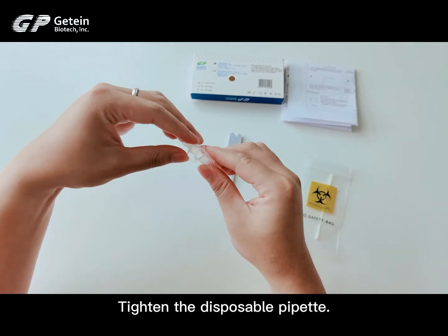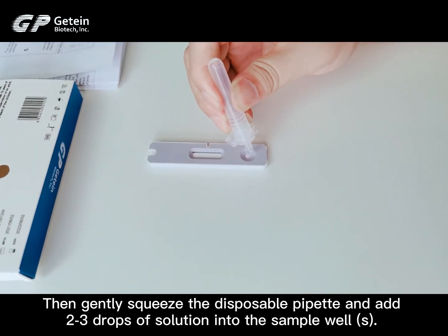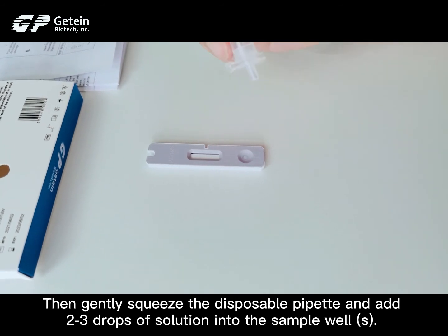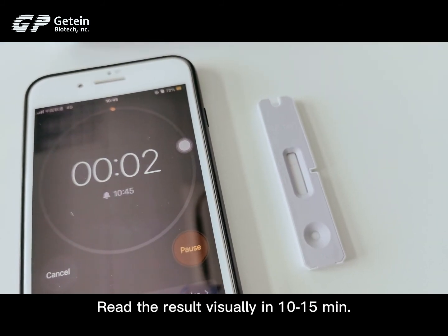Tighten the disposable pipette. Then gently squeeze the disposable pipette and add 2 to 3 drops of solution into the sample well. Set the timer as started. Read the result visually in 10 to 15 minutes.